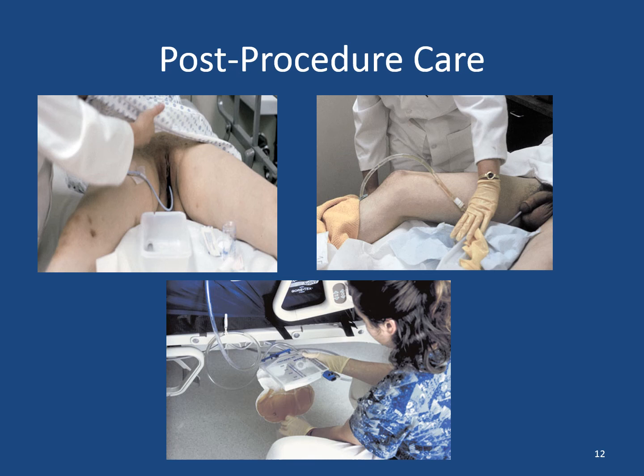Some facilities will also have a sticker or something that goes either on the catheter bag itself, on the drainage bag, or it goes into the chart, and it would have documentation on it that includes date and time the catheter was placed, the reason that the catheter was placed as well. And sometimes it either goes on the bag or in the chart. Double check the facility that you are at.